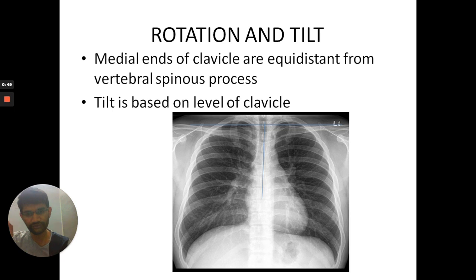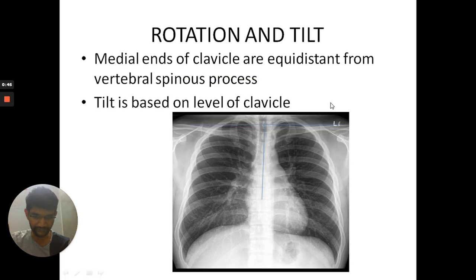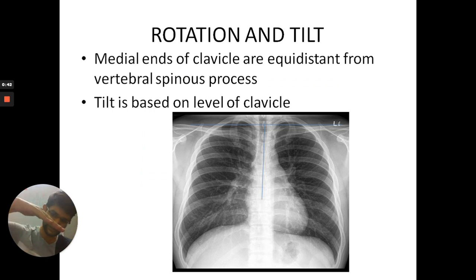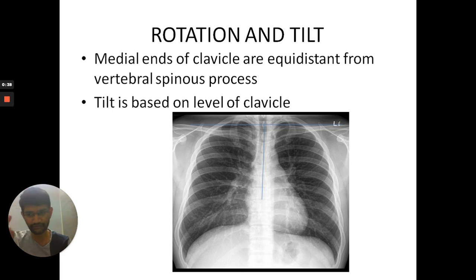To check for tilt, the level of the clavicle should be the same on both sides, left and right. If the clavicle is higher on one side it is tilted to that side — tilted to the right or tilted to the left. That is how you check for tilt.